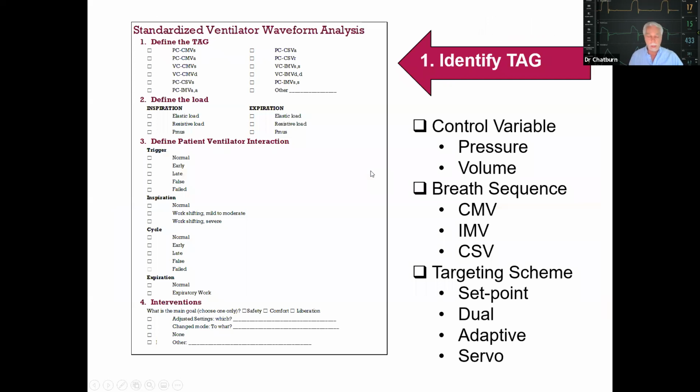Now, at the clinic, we have developed a standardized rubric or algorithm for going to the bedside and having someone look at the waveform, even if they know nothing about the ventilator itself, just looking at the waveform, being able to create a tag, which we call a taxonomic attribute grouping, or basically just a classification of the mode according to the mode taxonomy that was described in the paper earlier.